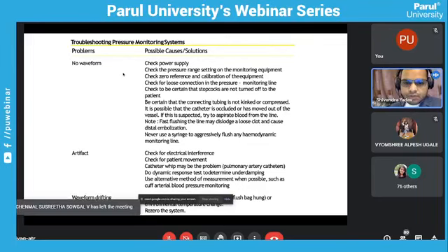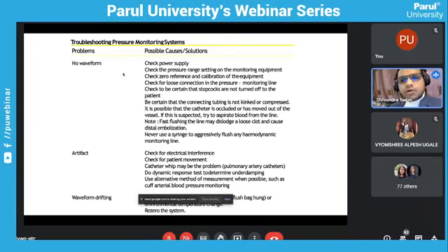as you know, in every procedure we perform, we have to give heparin because we are putting a foreign body inside, like catheters. Now, if there is no proper anticoagulation, there is a possibility that a clot can develop inside the catheter. And once there is a clot inside the catheter, that is a kind of block, and hence you may not get a pressure. But if this is suspected, you have to aspirate, take it out, aspirate. Do not flush it inside.